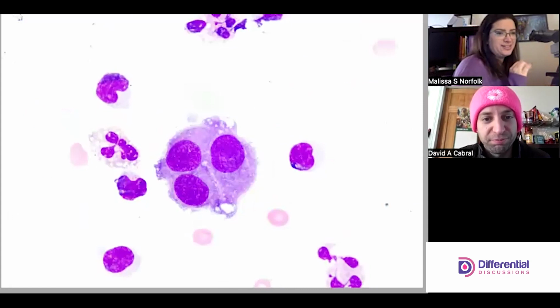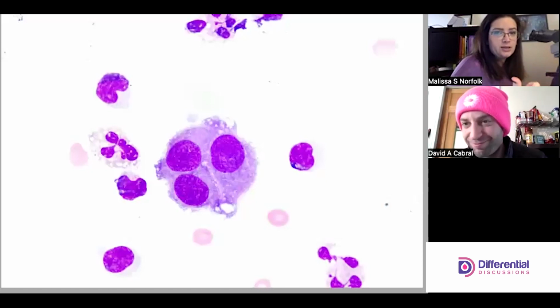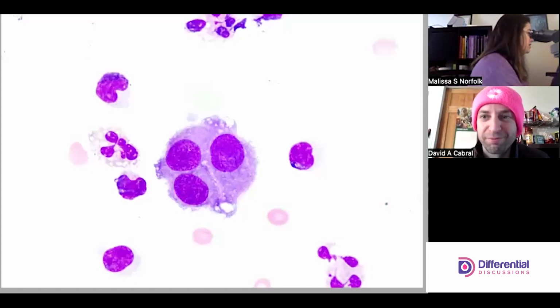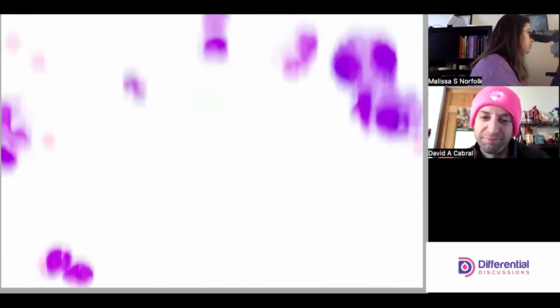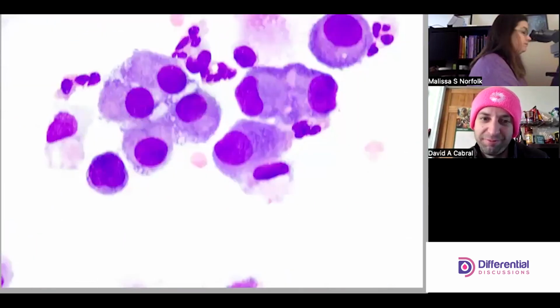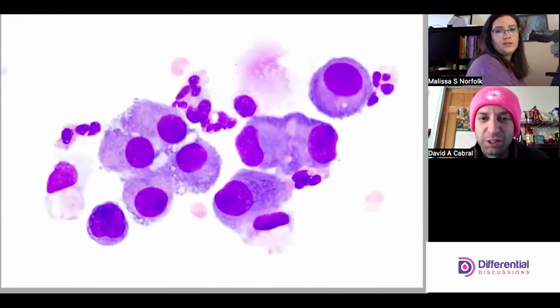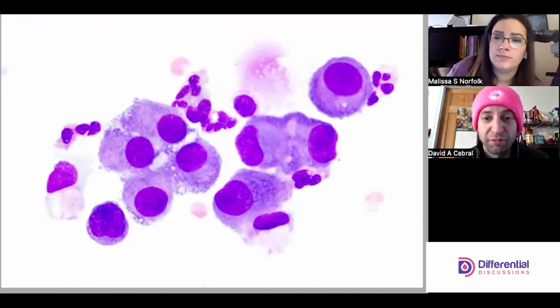So that big one is concerning, because so far, that's the only big ugly one that we've seen, and these mesos look like this. Cute, fuzzy, light coloration. Ooh, look. Lots of cute ones. A lot of meso cells, it looks like, for the most part.